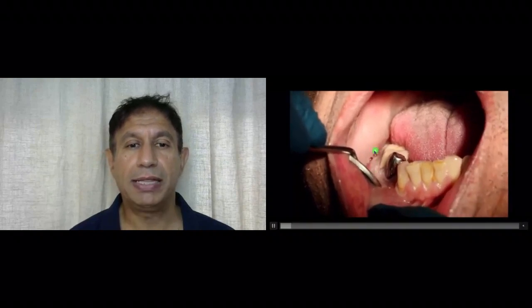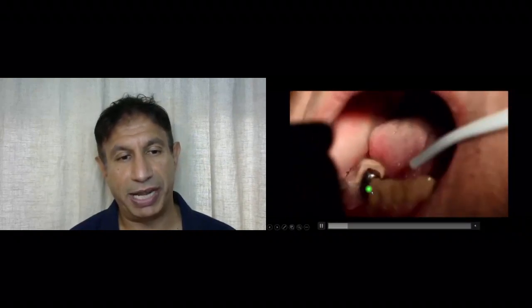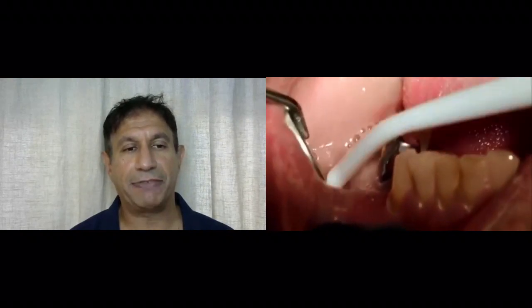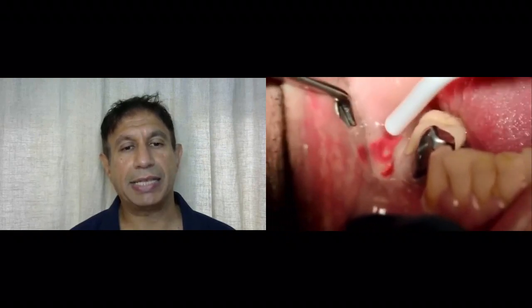So therefore, this is the buccal abscess in the posterior teeth. First we just drain the abscess, and then we've got to increase the length of the incision and go all the way down to the bone. You will notice that the knife is turned around, the blade faces anteriorly, and as it is put in, the incision goes from back to front and not from front to back.